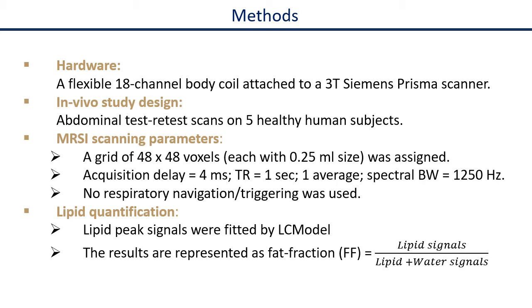For the MRSI scanning parameters, a 48 by 48 voxel matrix was assigned, where each voxel has 0.25 milliliter resolution. The study was performed with one average and without implementing respiratory navigation or triggering. For lipid quantification, lipid peak signals were fitted using LCModel software before the fat fraction was calculated using the shown conventional fat fraction equation.